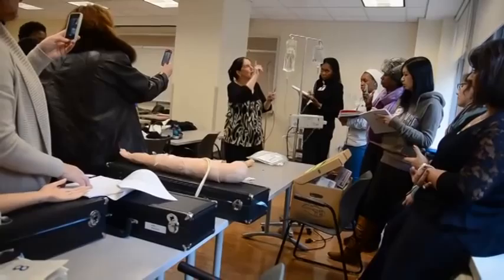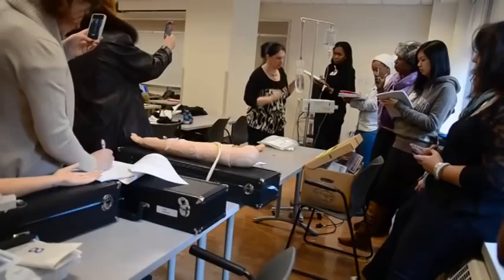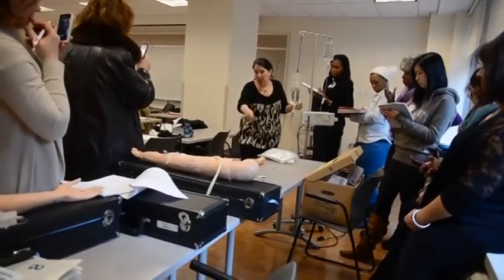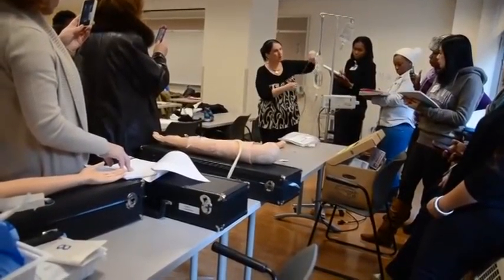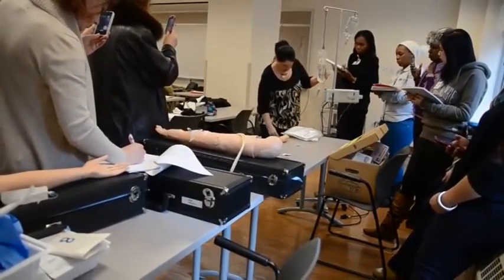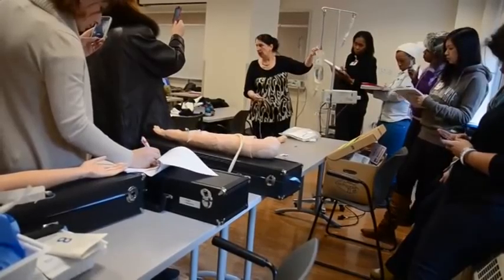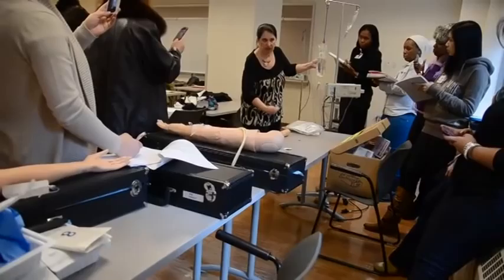What I'm going to do now is lower this one, because this is the one that's running. I'm going to clean this off. I have my non-sterile gloves on. Students say, well, you're not dealing with it. I said, no, you have to wear clean gloves because I have to go assess the site and everything. I'm going to clean this off and put it here. Now you see how it reaches this one? Why would I use all that long tubing if this is where I'm going?